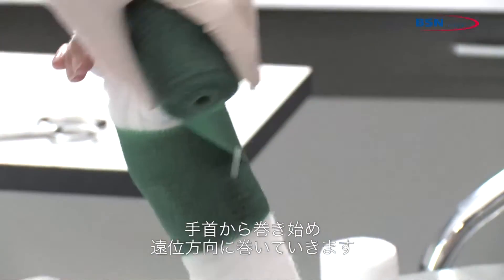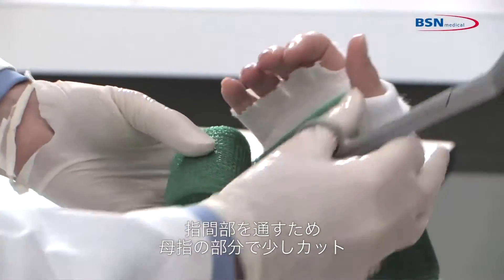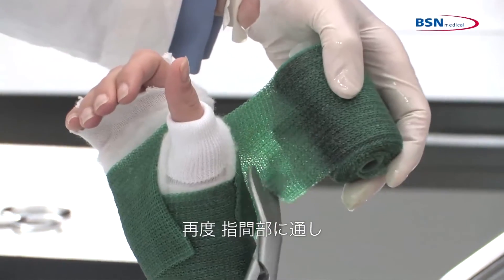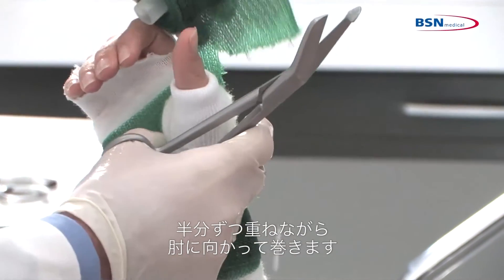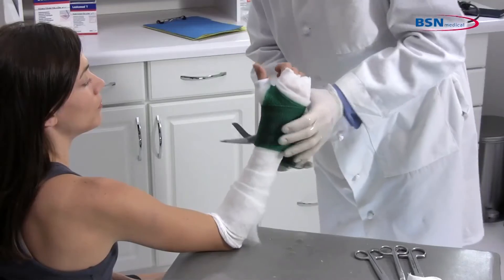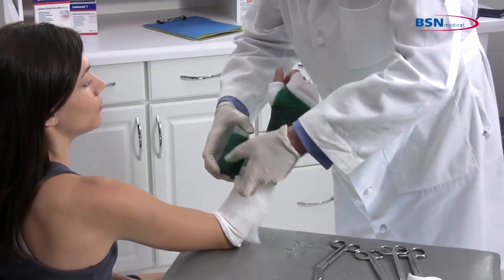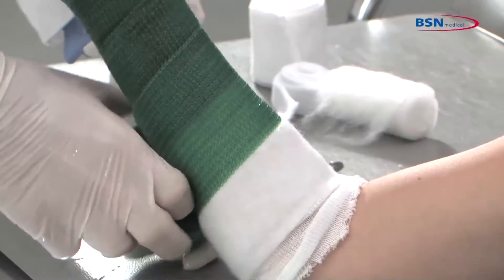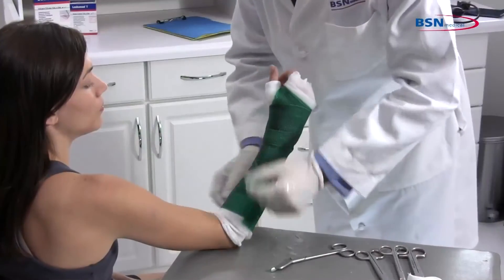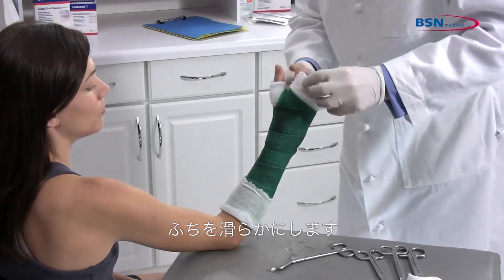Start wrapping the cast tape at the wrist working distally to the hand. Make a cut at the thumb to easily pass through the web space. Curl the cut edges of the cast tape under to create a smoother edge. Pass a second time through the web space and continue working toward the elbow, overlapping 50%. Fold back the stockinette at the proximal and distal ends, creating a cuffed end for a more comfortable fit.